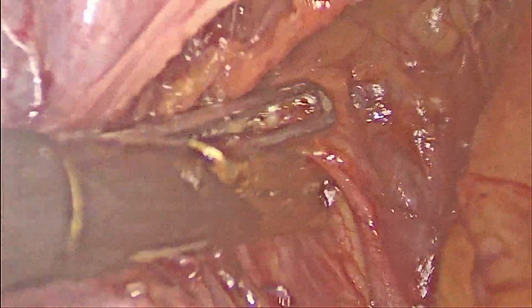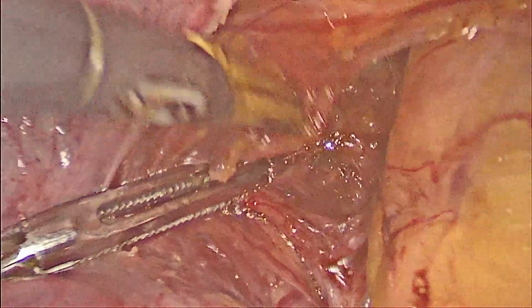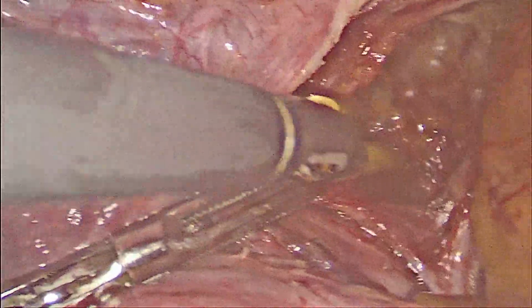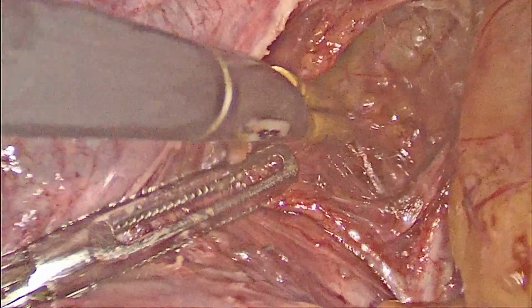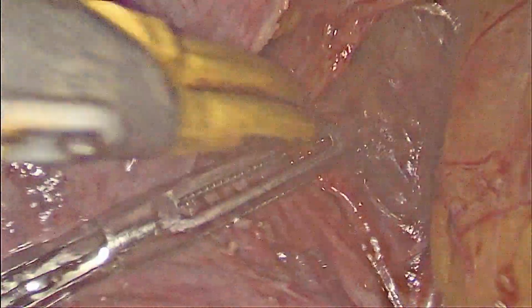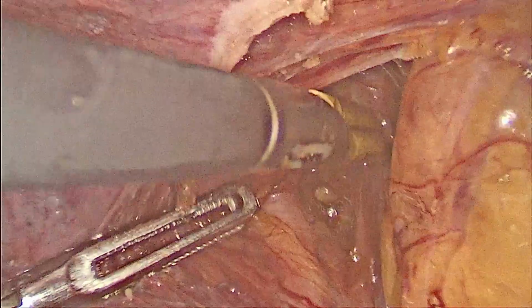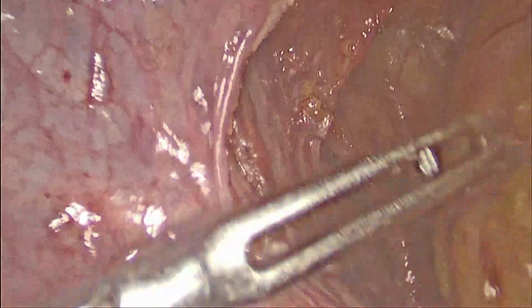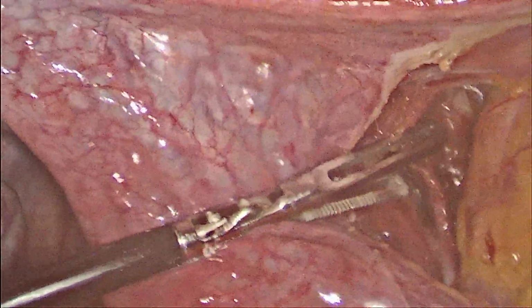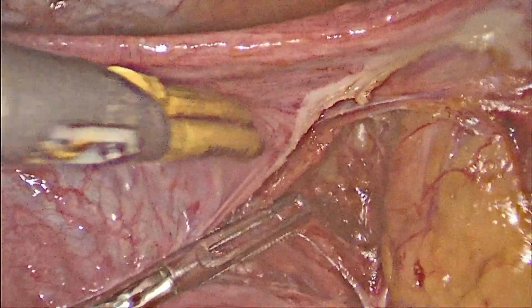Scar pregnancy will have a rich blood supply from the uterine artery and its branches, which will increase the blood loss during dissection. Though we have given a vasopressin injection at the site of the scar pregnancy, that may not be sufficient to reduce the blood loss during evacuation of the contents of the scar pregnancy.